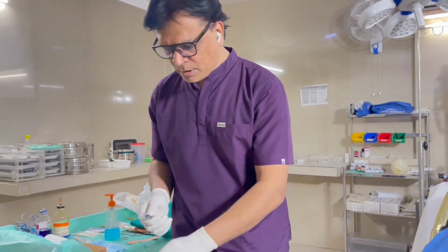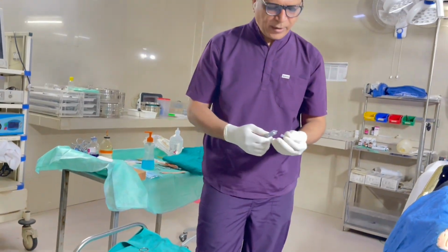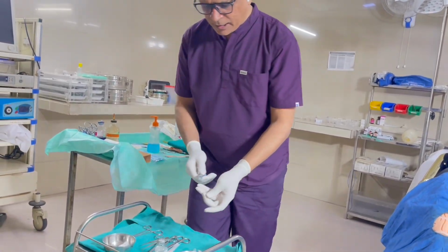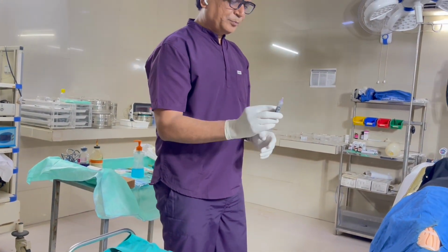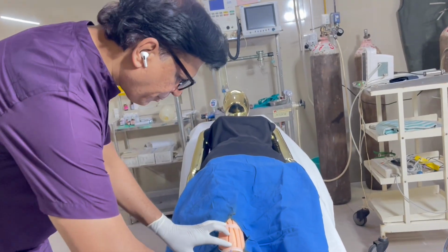So once I get this, the needle which is there, that has to be disposed and put a 25 gauge needle. So once then I keep a 25 gauge needle, another needle. Then Miss Linda, you will be getting a small, very small prick.